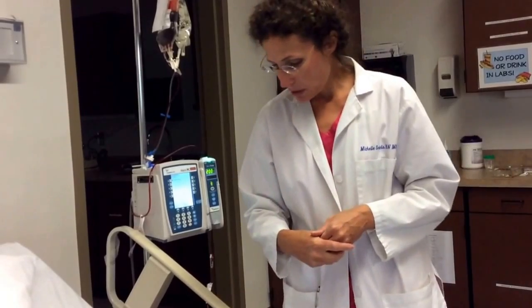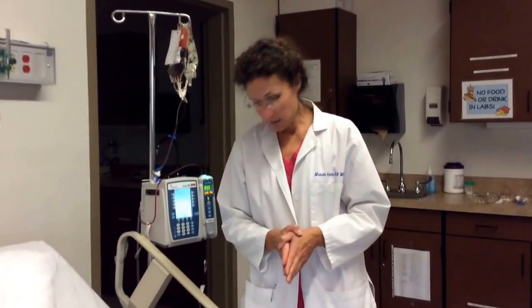And I'm going to start at this time. So at this point, I would make sure that Mr. Smith is comfortable. I would tell him that I'm going to be in every hour and we'll check vital signs. I'll do an assessment, make sure his IV site still looks fine, and make sure there's no issues occurring. I would talk with my healthcare team, so if I have a nursing assistant, LPN working with me, they know when vitals are due and to inform me if there's any concern.